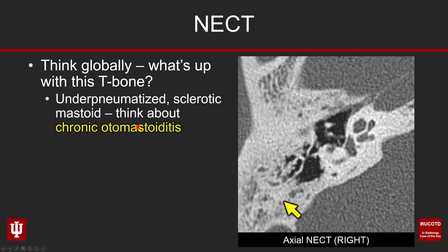This patient has an under-pneumatized and sclerotic appearance of their mastoid, denoted here by the yellow arrow. This mastoid is really dense, sclerotic, and poorly pneumatized. When you see that appearance, be thinking about a patient who has chronic otomastoiditis. That doesn't fully explain the hearing loss in and of itself, but it may be a contributing factor.